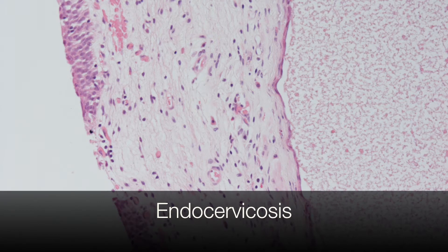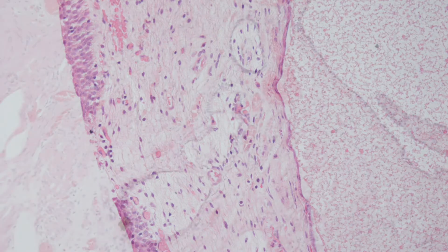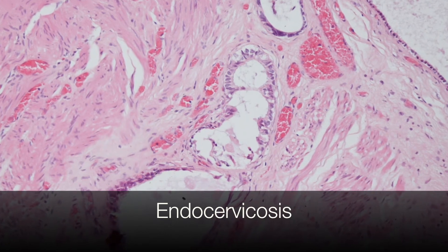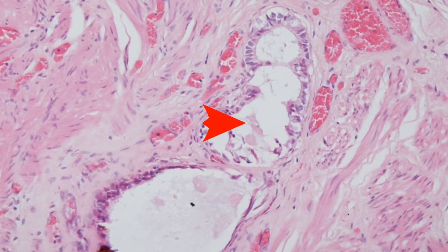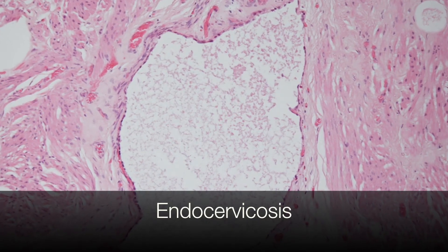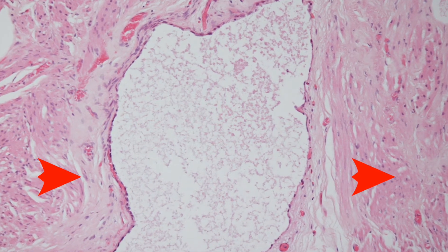This is a high-power view of the endocervicosis in the bladder. You can see normal urothelium on the left. On the right is part of the cyst lined by a single layer of flattened epithelial cells. In this focus there are smaller glands lined by columnar epithelial cells. This piece of bladder wall shows a focus of endocervicosis in the deep muscle.